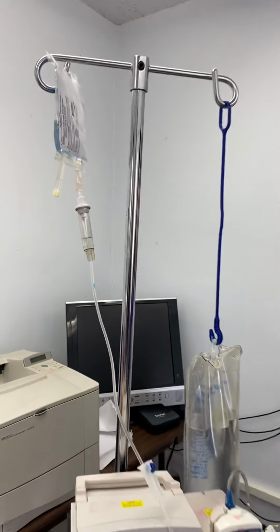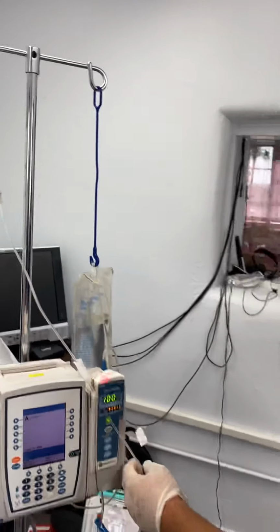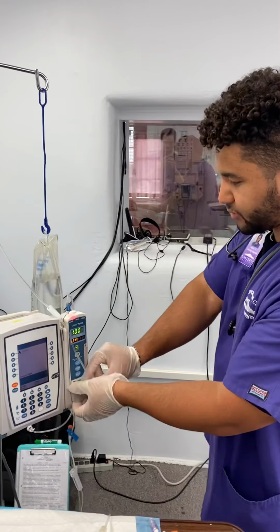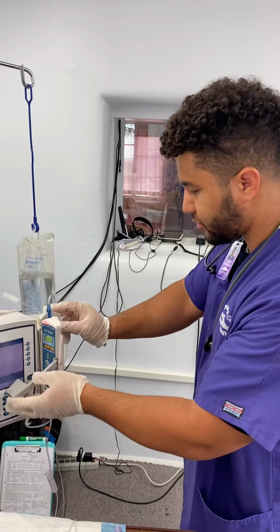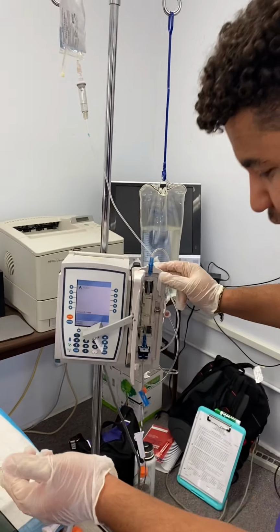All right, and there we have our second one. But we do have some air in the line, so we do need to check this out and make sure that there's no problems. All right, now you do want to trace it all the way back up.